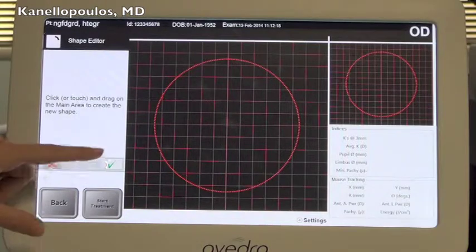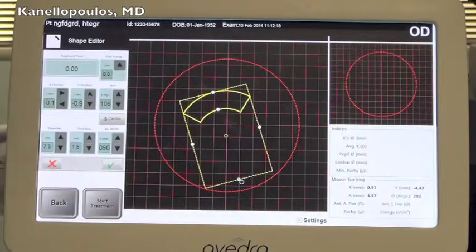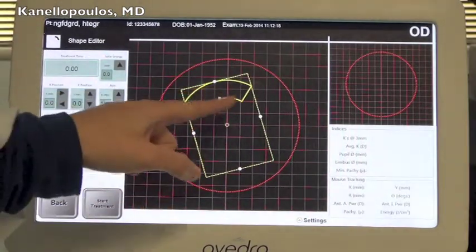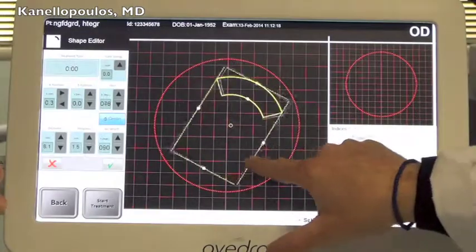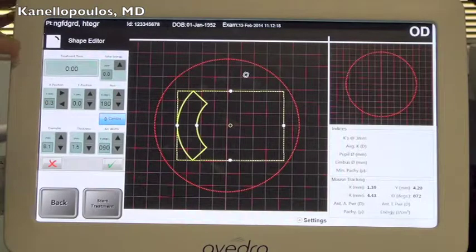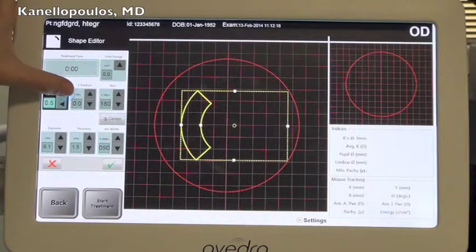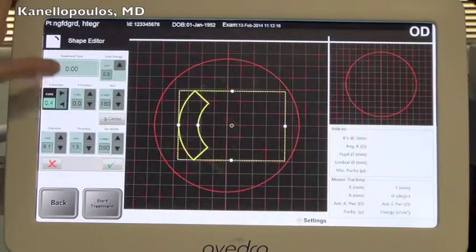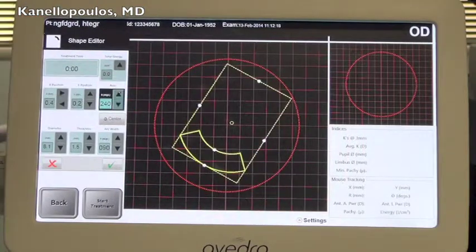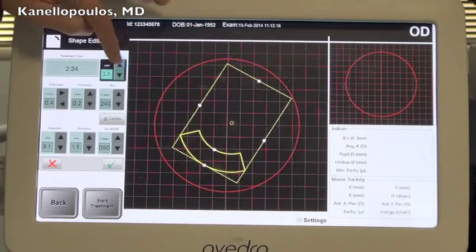And as you can see, this gives a multitude of possibilities. This is now just an arc treatment to treat, for instance, over a new or reopened astigmatic keratotomy, and we've published the ability of this treatment, and we're adjusting the arc of that treatment and its axis and its decentration XY, depending on what the data are on our clinical exam and topography.